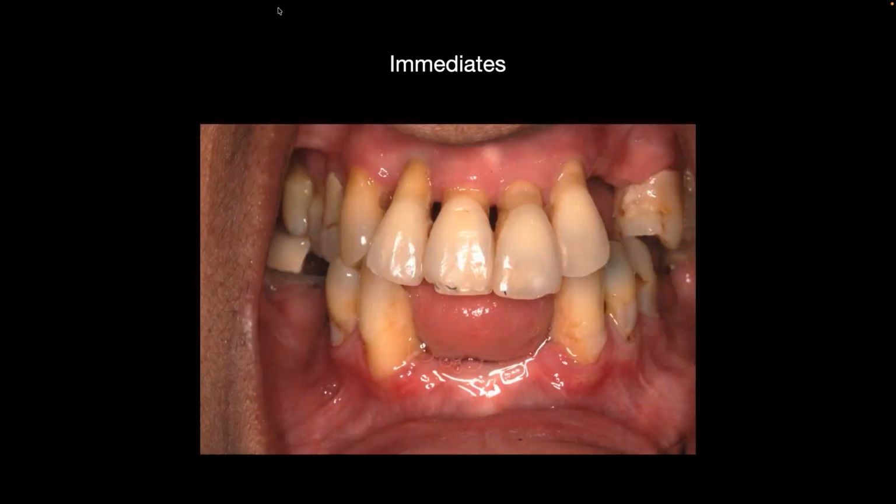You can go ahead and use your digital impression. I can totally do that, use a digital impression, make my denture based off of that, because I know I'm relining that denture later. And that can provide you with a lot of advantages, one of which being a case like this, 7, 8, 9, 10, blowing in the wind. They are very loose.